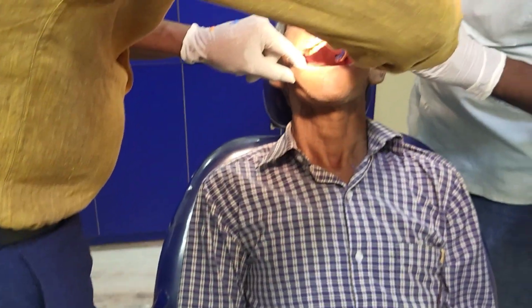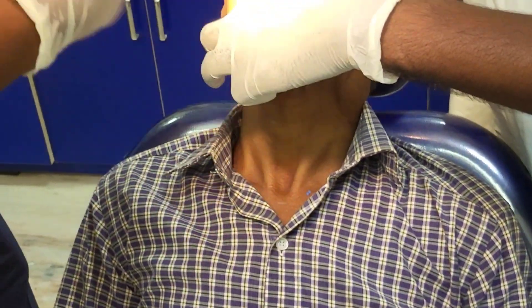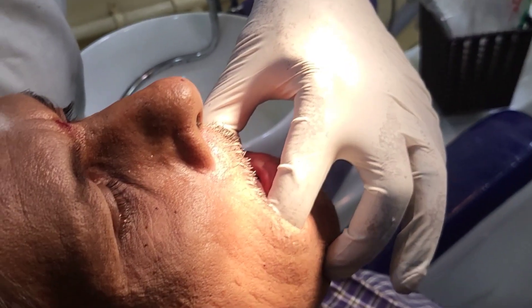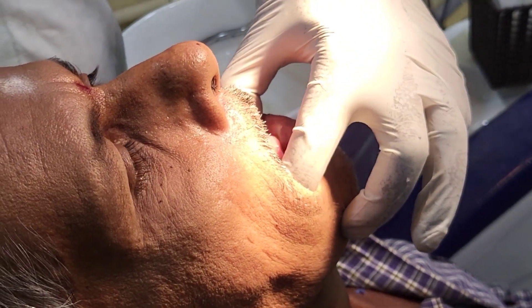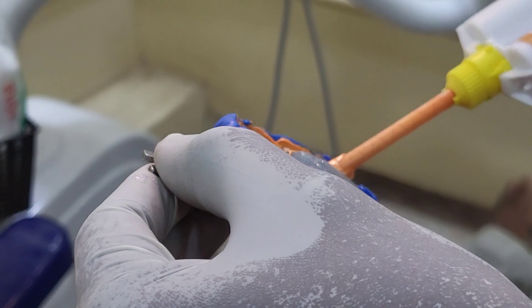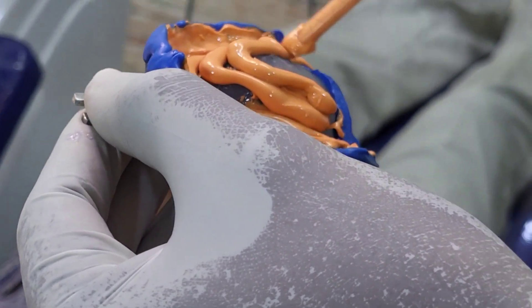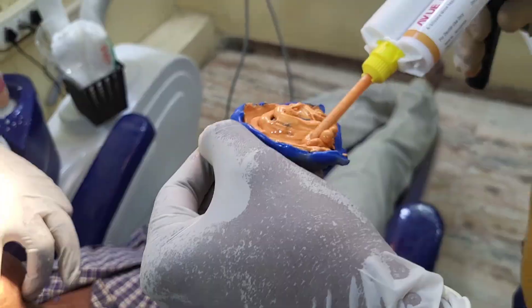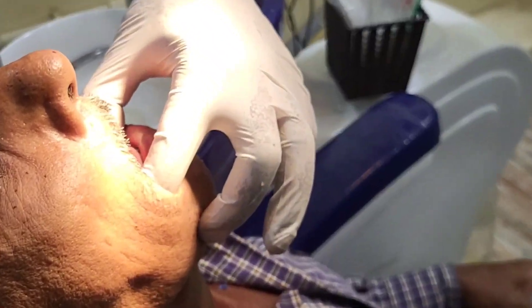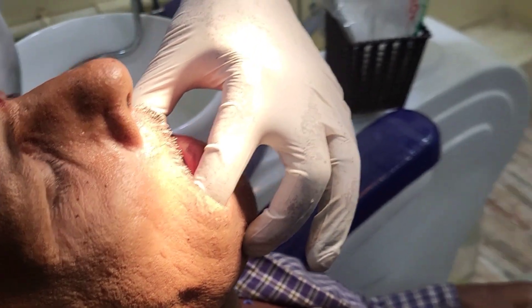After loading the light body, we place it in the patient's mouth, retracting the left side with the assistant's help and the right side ourselves. We ask the patient to do the tongue movements again. You can see the patient moving the tongue right and left and touching the cheek on the right and left for the mandibular secondary impression.